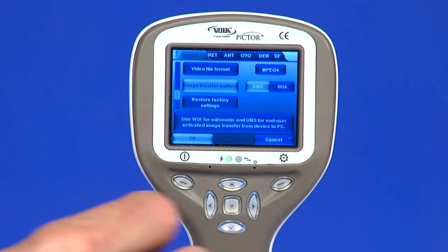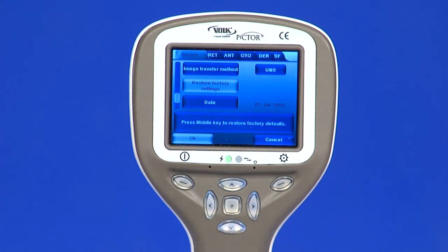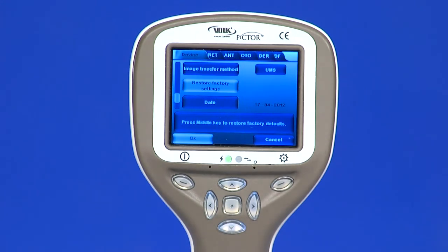Restore Factory Settings: by selecting Activate in the device menu and pressing the middle key, Restore Factory Defaults, the original factory settings will be returned.